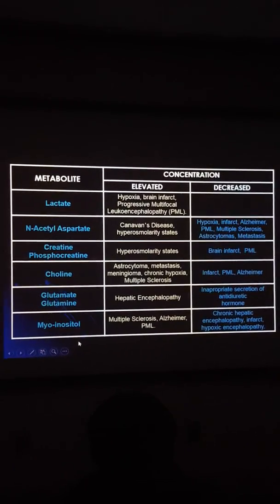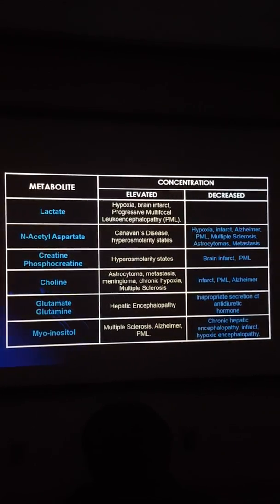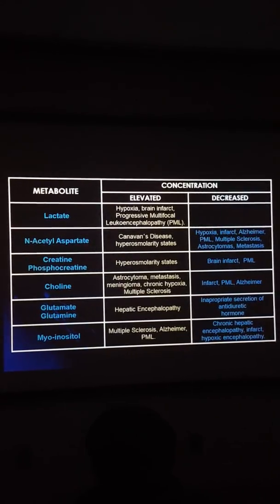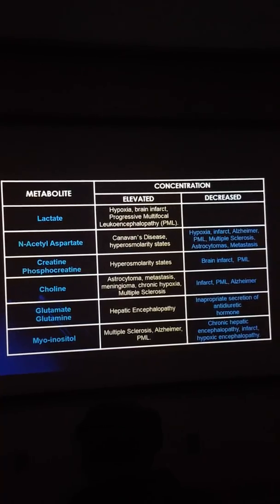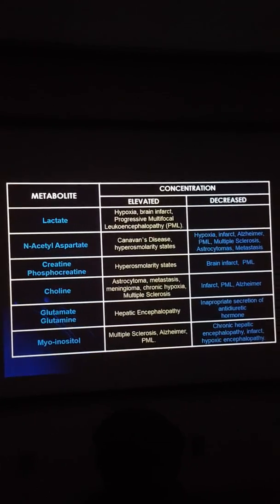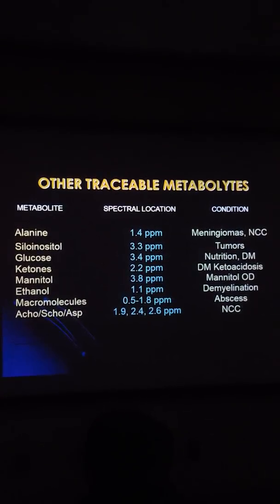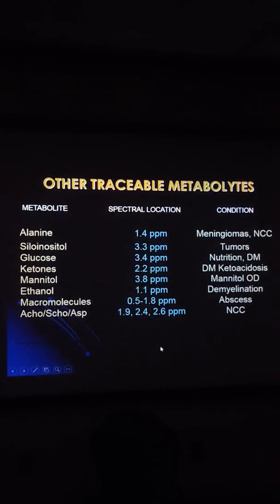So this is a very detailed ability for us to map out different pathologies, because depending on specific metabolites that are abnormal, you can actually be able to tell specific conditions in the brain. Okay, so this is a very powerful technique, and we're not doing it justice in 45 minutes, but I'm just trying to give you an idea of what the potential is of this technique.